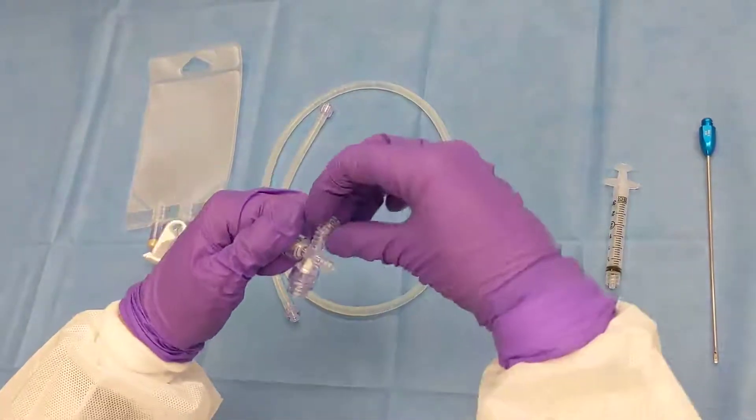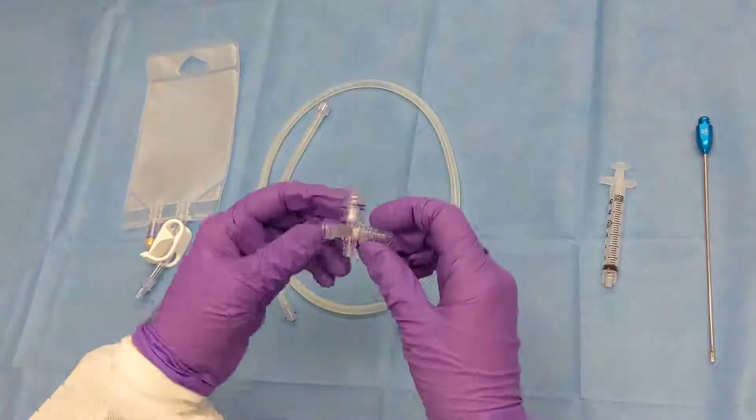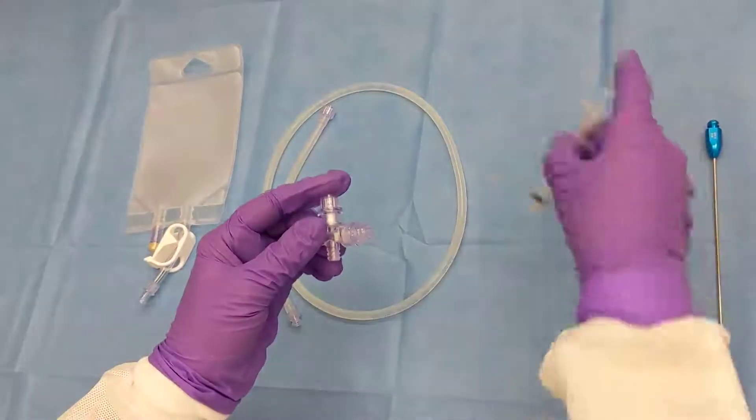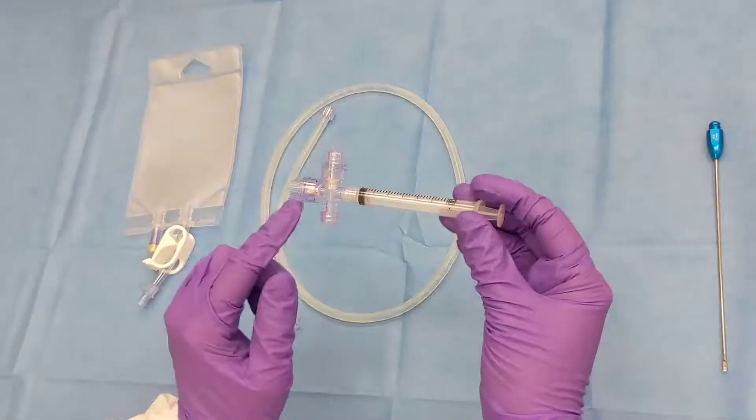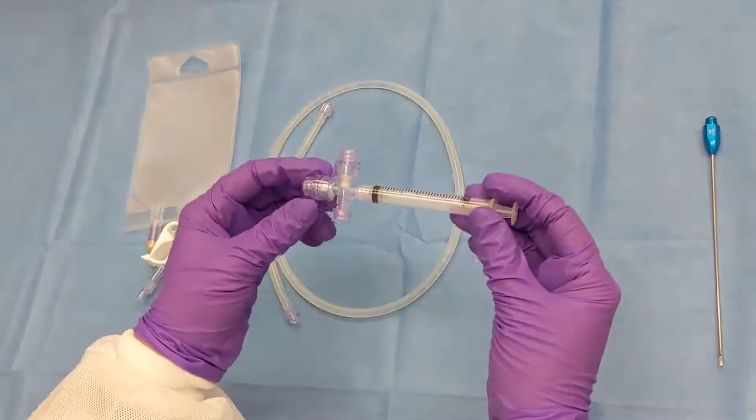Switch the cap to the other open female port and connect your syringe to the AT valve where the arrow is indicating outward.